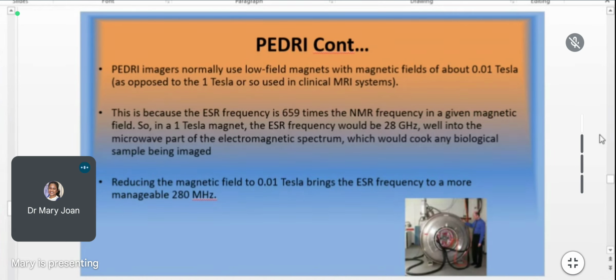It is not ionizing radiation which we are using, but because of this magnetization, demagnetization, application of resonance signals, RF pulses, what changes it produces in the body and how it can have a negative impact in the future, we do not know because we do not have knowledge about those minute levels. Whatever changes are there, they are very minute and may not directly result in any serious changes.